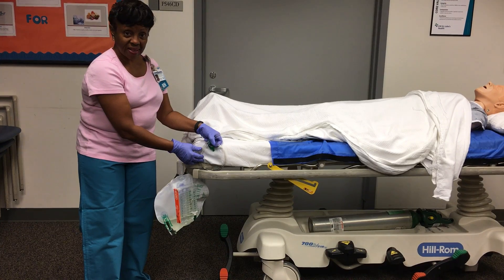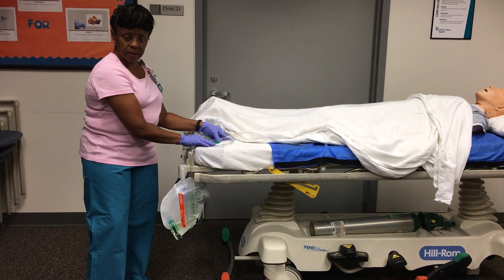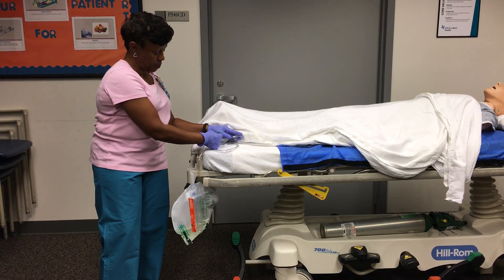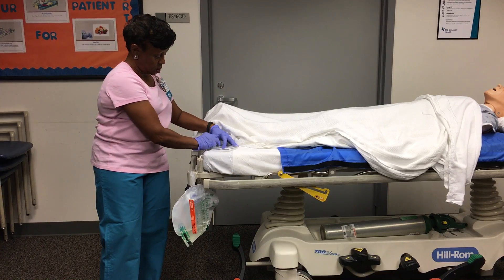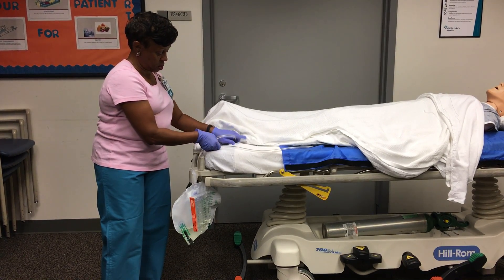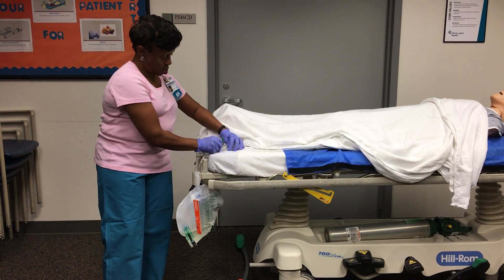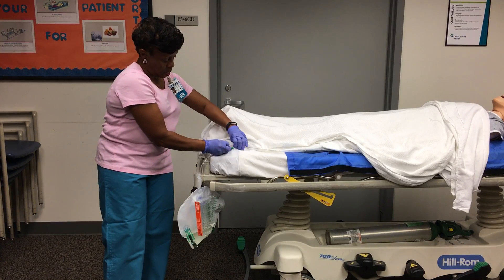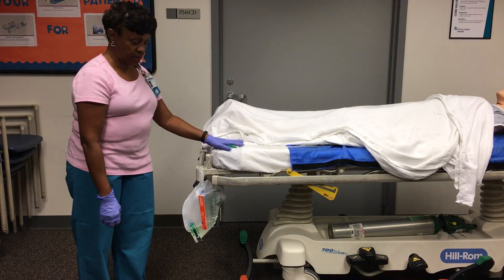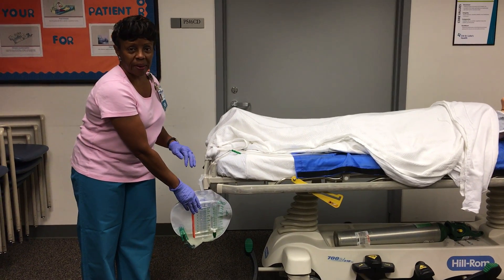The loop must never hang like this, but it is perfectly fine to hang in this position. I have my clip in place to hold it in position, and it can either lay like this, which is what it's trying to do, or in any other manner, as long as it is flat and I have a straight line down to my urine bag.